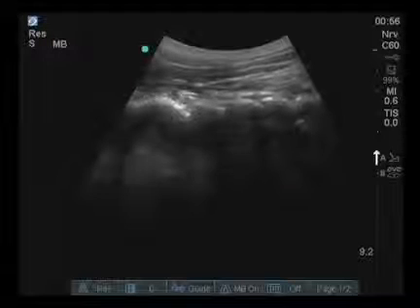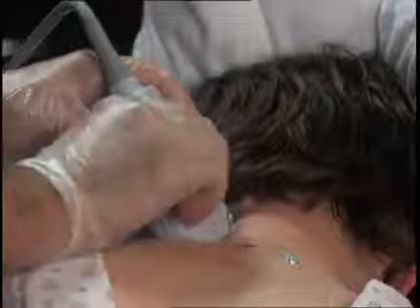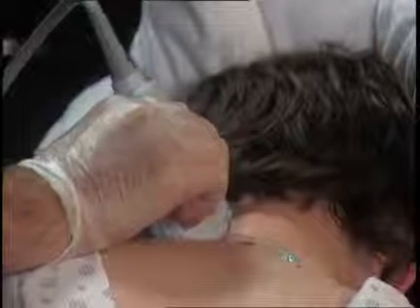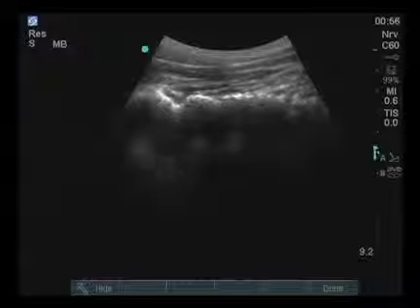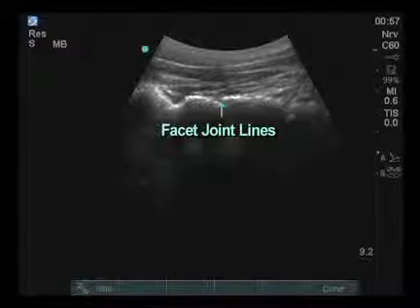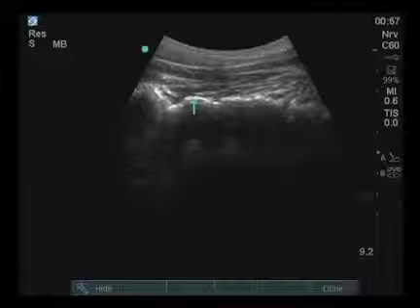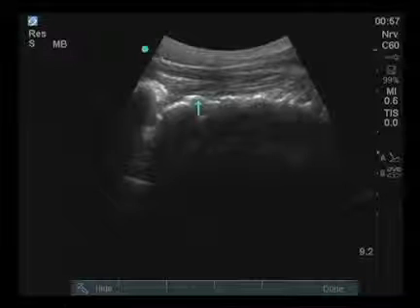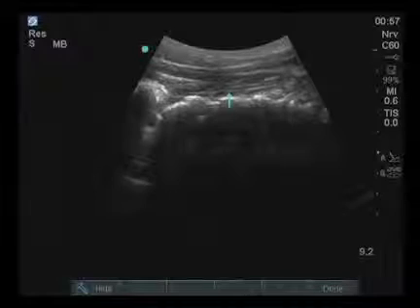Other potential views include the craniocaudal orientation or sagittal plane of the probe, placed along the neck and slightly off midline. Again, new structures can now be seen. In this particular case, the facet joint line is very clearly indicated at these locations. The actual location for a medial branch block would be on these superior surfaces on the lateral mass.